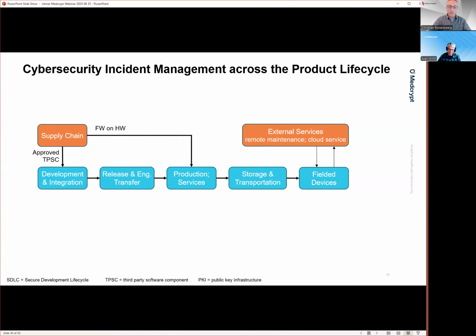And we have seen already over the last few years a number of security incidents that started at a manufacturer-provided service, but had implications on care delivery via field devices at the hospital because that service was compromised. So again, in this day and age, we live with much more complex infrastructure. But back to my initial point, security incidents can happen anywhere.